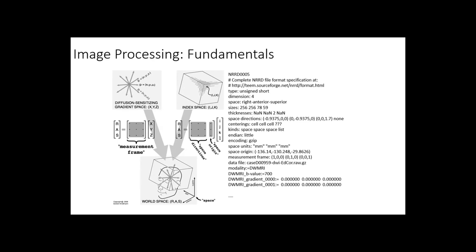Suppose you're doing image processing, working on this image, you are supposed to get a better result than this one. But for this one, the image size is smaller from the storage point of view. So there's a lot of information we have to specify before you can really process your image. So we need a standard. Oftentimes we call this a header file.